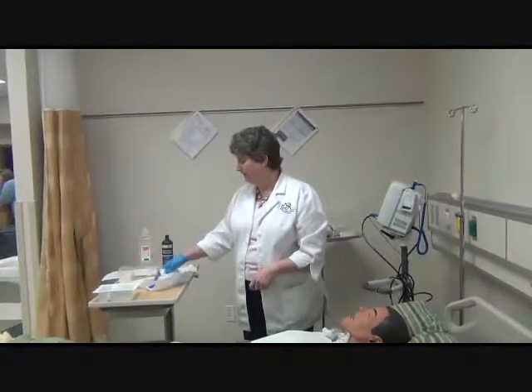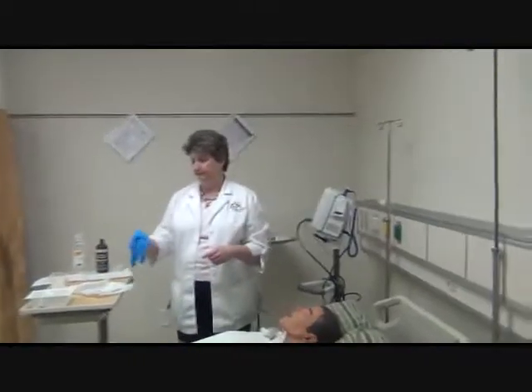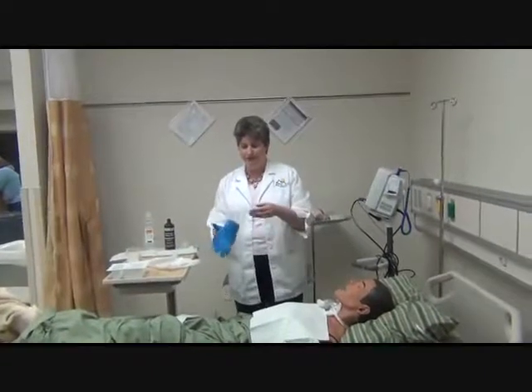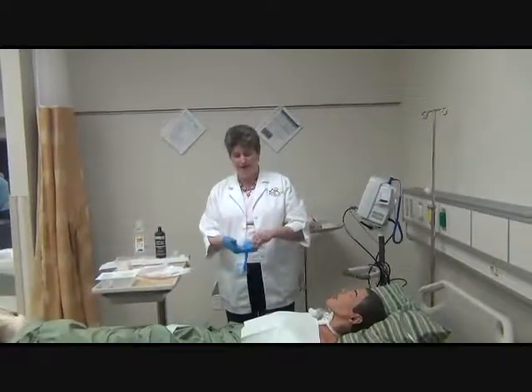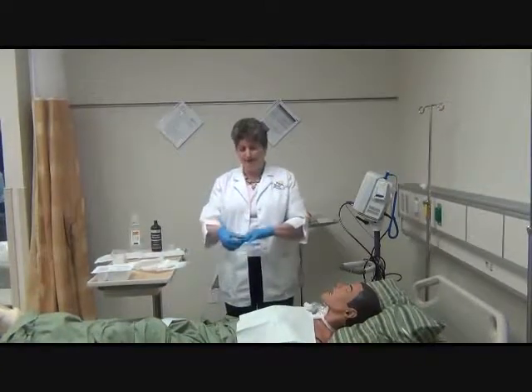At this point, I want to turn on my machine. It is helpful if your machine's on the same side of the bed, but you may not have that luxury, and if that's the case, then turn on your equipment before you start this procedure.